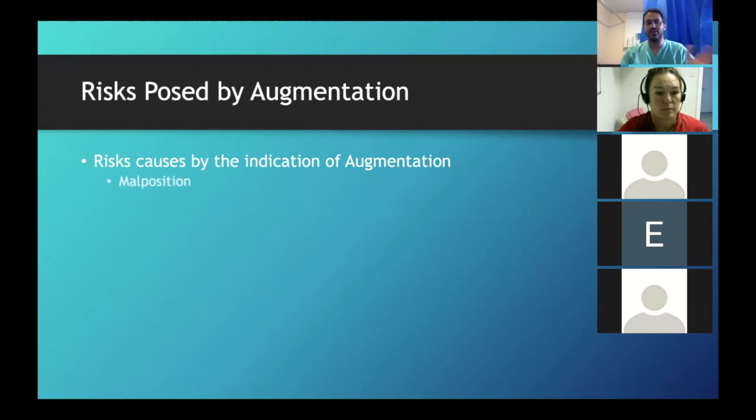So most of the time, if the contractions were there and then have stopped, which is what I hear frequently in the second stage, "Oh yes, she was contracting very well on her own. She's now fully dilated and suddenly the contractions are only now 1 in 10." Yeah, there's a malposition there. Even though the head was stretching the cervix at the beginning, the moment the cervix is gone, the head is now not stretching the perineum. So the reflex has broken. Most of the time it's a malposition, okay?